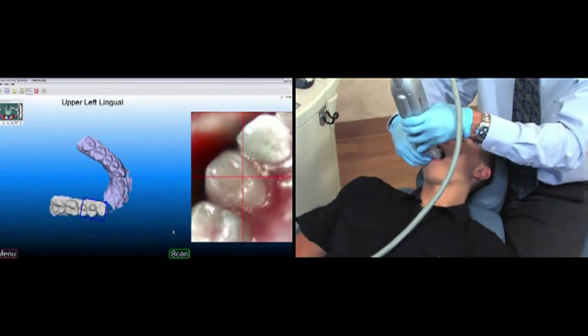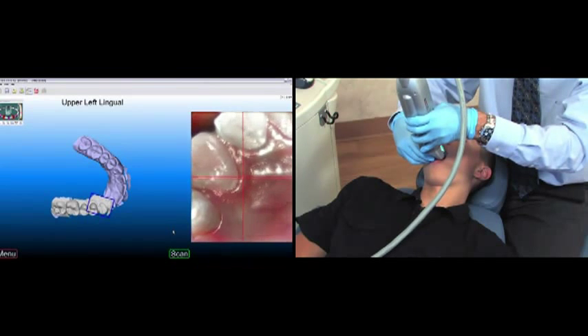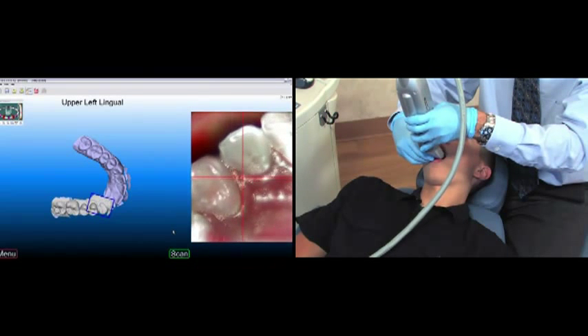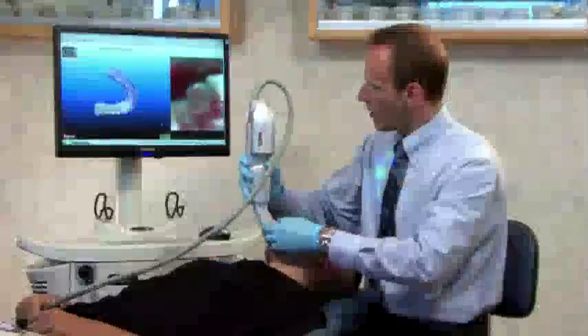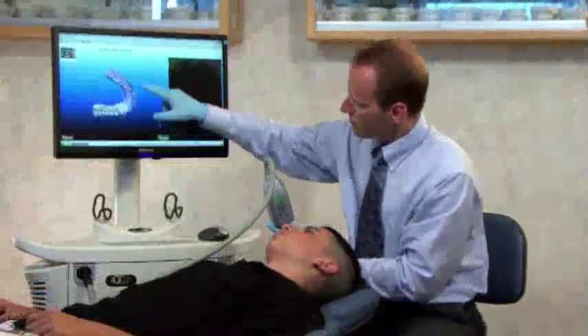We continue with the upper left buccal and upper left lingual scans. As we fill in the scans, the IOC scanning software stitches the two halves together at the midline. The upper arch now appears to be complete.